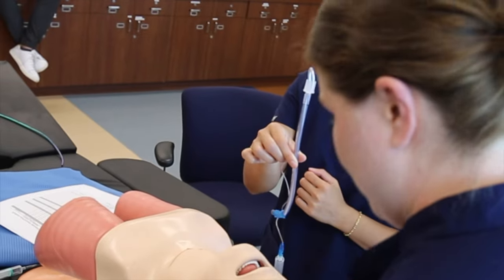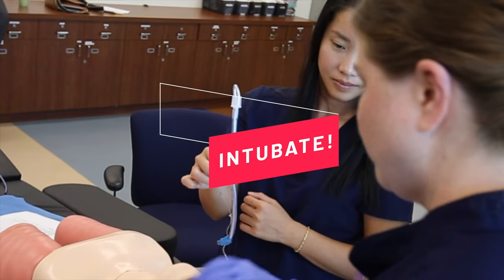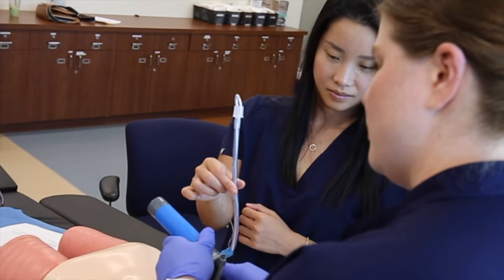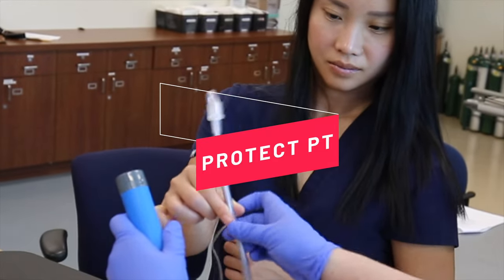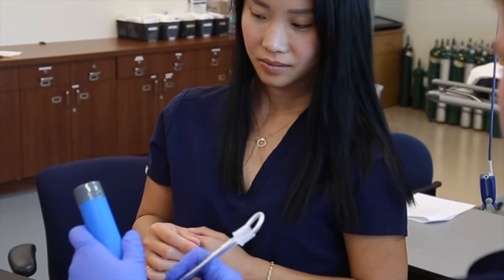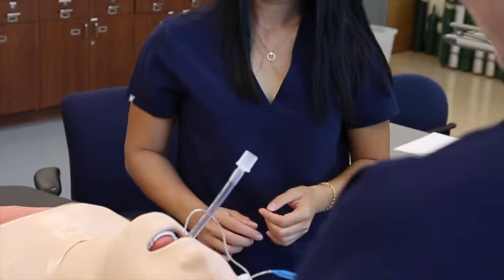All right, so time to intubate. You're going to bring the bed up to whatever height you need, which makes it ergonomic for you. You are going to scissor, put the blade in. You're going to sweep the lips, make sure that you don't have a lip pinched. And you're going to lift. I have a grade 2A view. Thank you. And through the cord, stylet out, please. Thank you. And then I'm going to inflate my cuff.